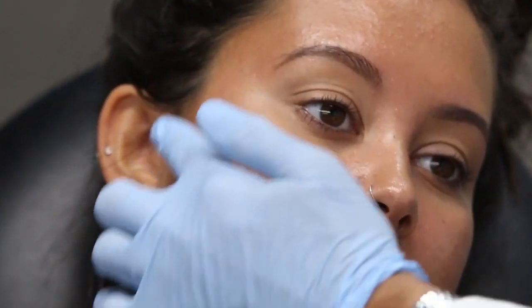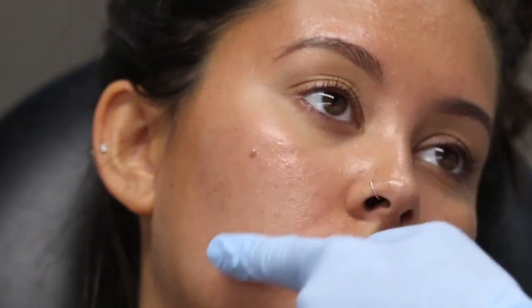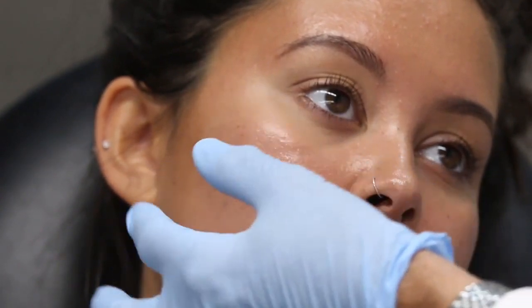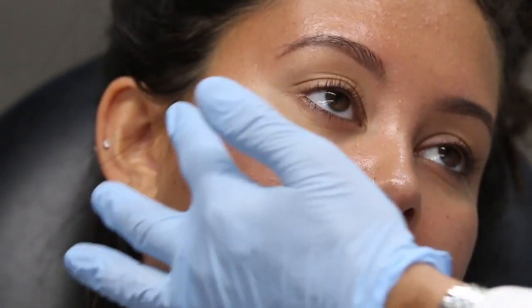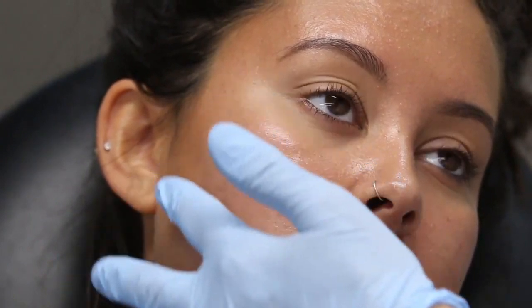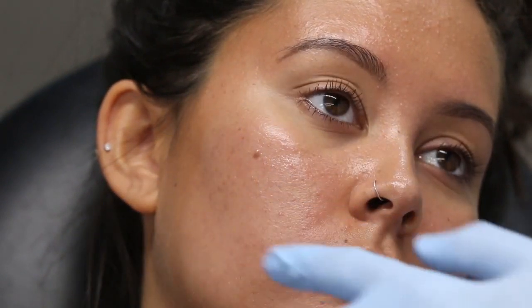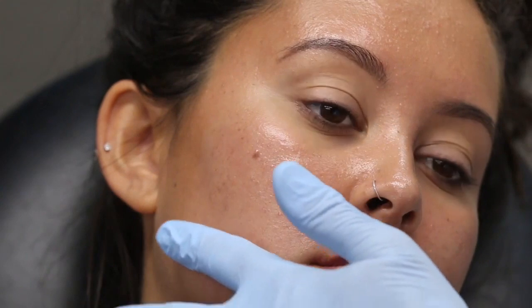We've covered this area. Why did we cover this area? For a couple of reasons. Number one, she had pretty bad acne scarring in this area, and number two, that's going to really build collagen in this area, new vascularization, neocollagenesis. You can see after 2 treatments, this is going to be her 3rd treatment, her skin is really smooth, much better than what we started with.